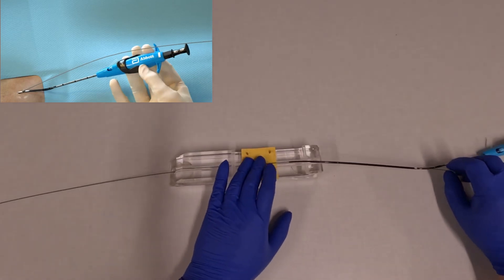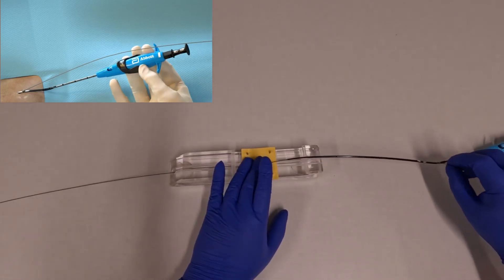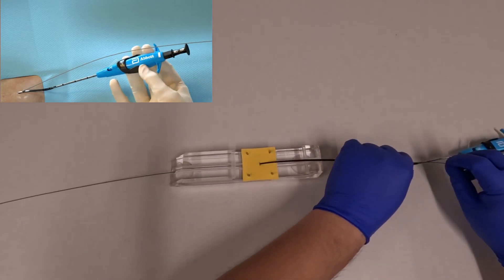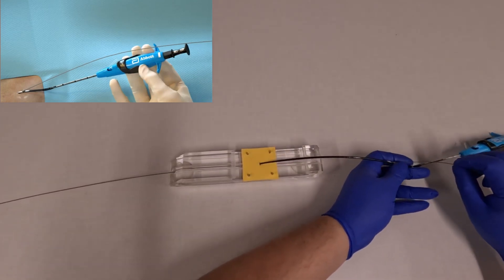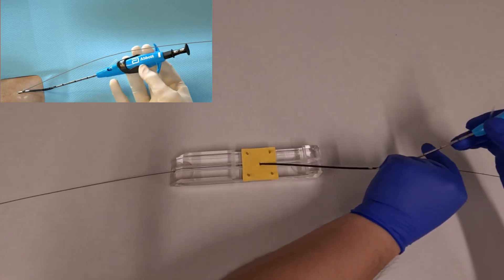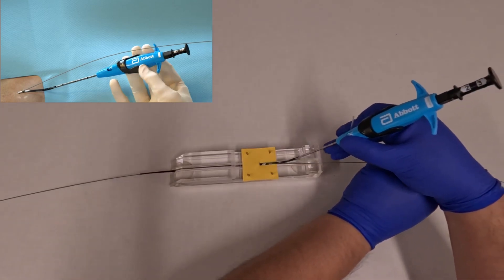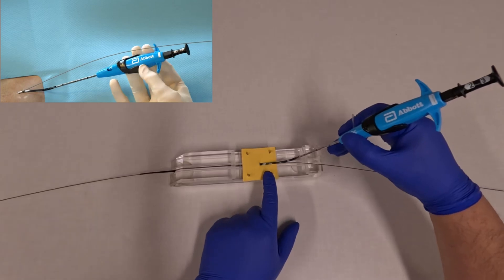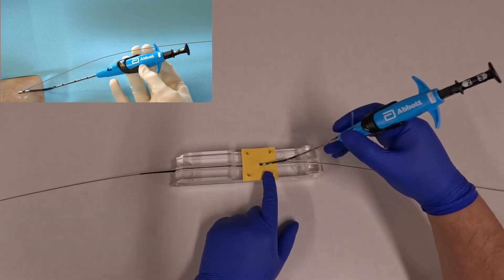Remember that you're maintaining manual hemostasis at the site until this point. As you advance the Perclose into the arteriotomy, the device will actually allow for hemostasis. So at this point you can relax and take off manual pressure.